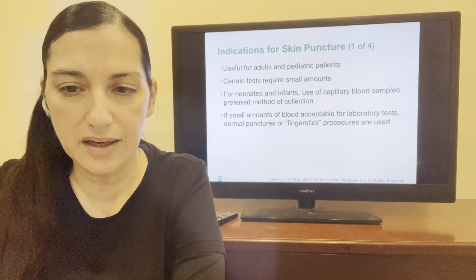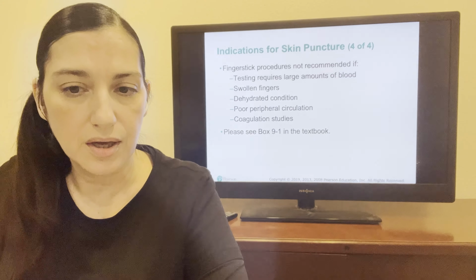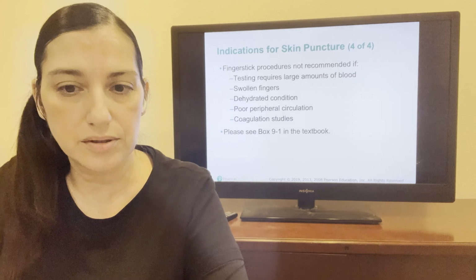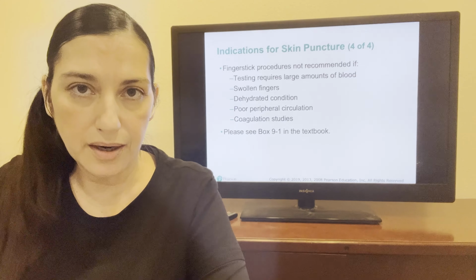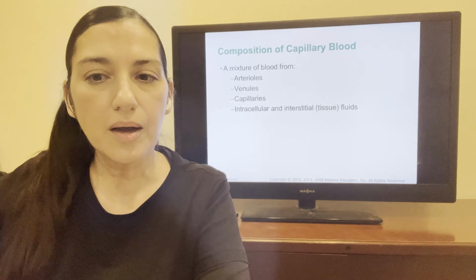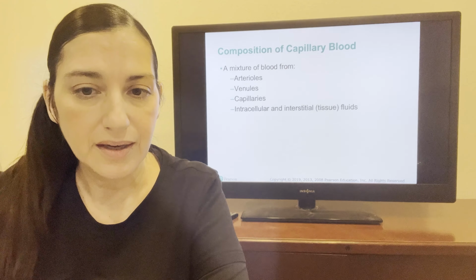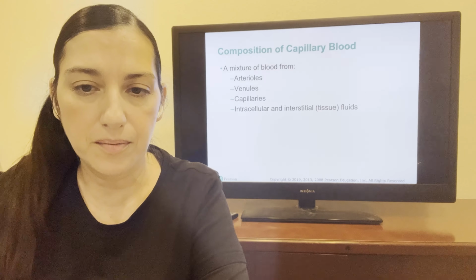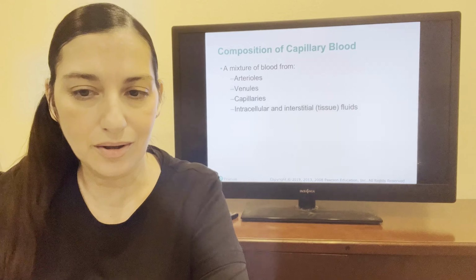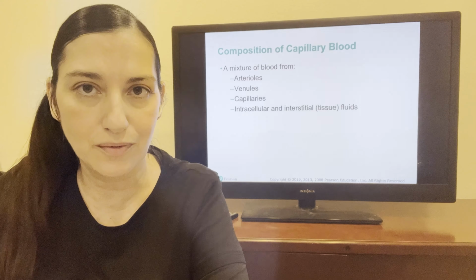Finger stick procedures are not recommended if the testing requires large amounts of blood, the patient has swollen fingers, is in a dehydrated condition, has poor peripheral circulation, or coagulation studies. Please see box 9-1 in the textbook. Composition of capillary blood. It is a mixture of blood from arterioles, venules, capillaries, intracellular, and interstitial tissue fluids.